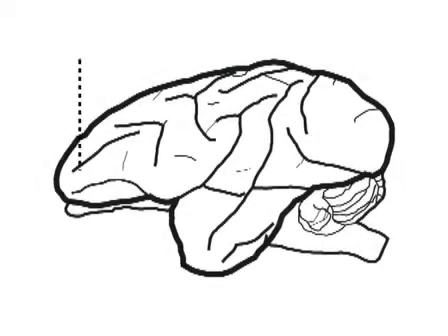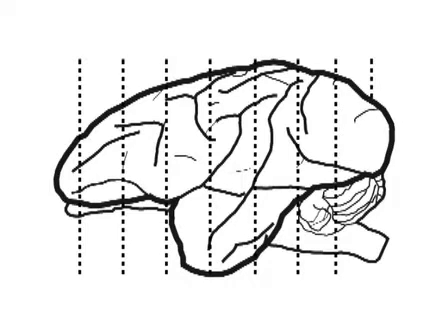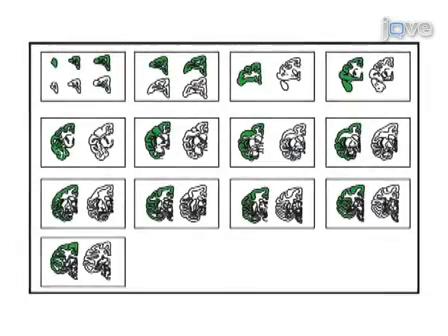This procedure begins with defining the reference space. A stereotaxic atlas may be helpful in determining the boundaries of the area of interest. Next, organize the slides and determine the section sampling frequency.